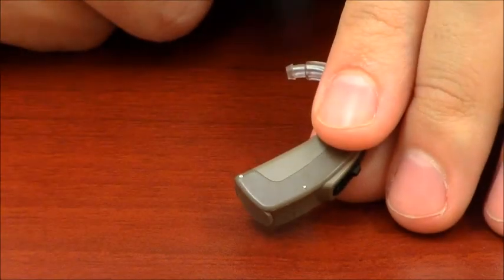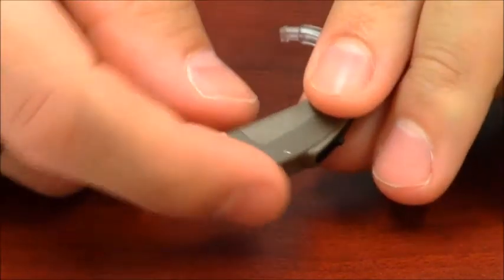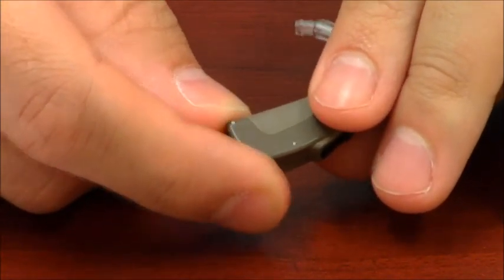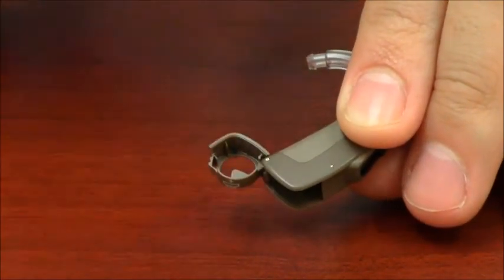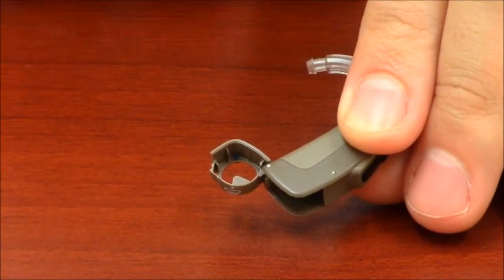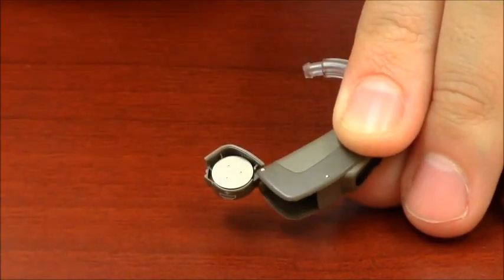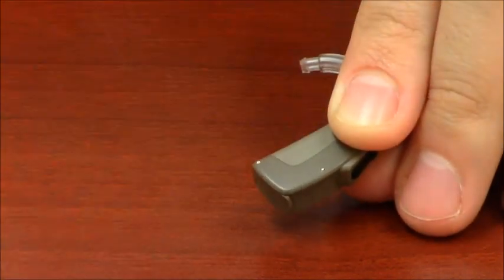And most behind the ear hearing aids will have their battery door at the bottom. And again, there'll be a little ridge close to the side of the bottom of the hearing aid. And again, you're going to pull out with your nail or your finger on that ridge to open the battery door. With the behind the ear, again, you want to have the flat side of the battery facing up in the cradle, and then once you have it in place, just simply close the battery door.